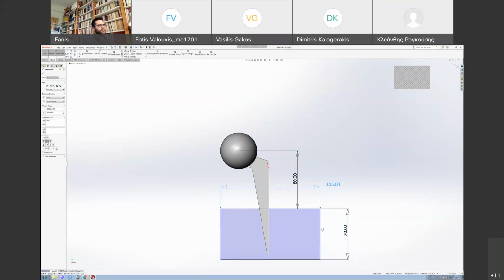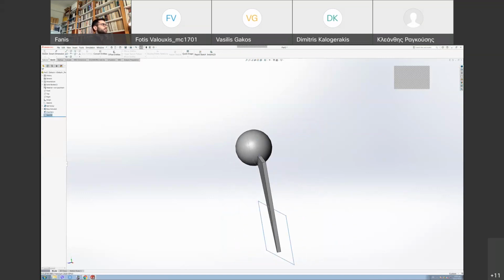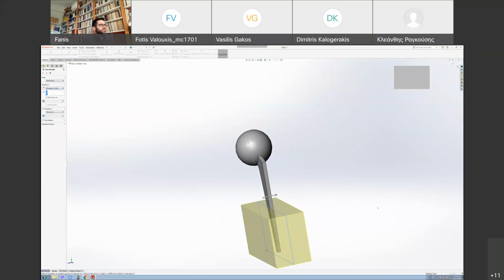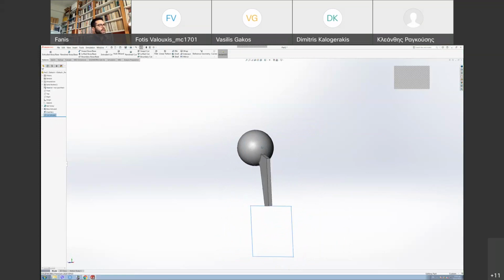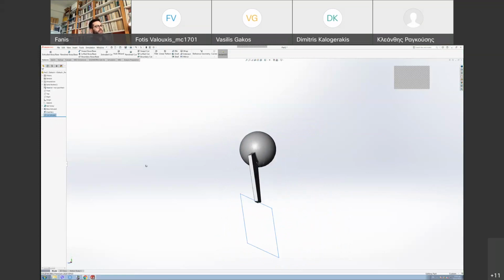And I need to define this. Yeah, to test this. Okay, that's now fully defined, and we're just gonna cut it. We're not gonna do anything more to it, so it's just an extruded cut. You go here, you go through all both, so you completely cut it. Okay, you don't leave anything, and you end up with this model that we're gonna use for the finite element analysis.